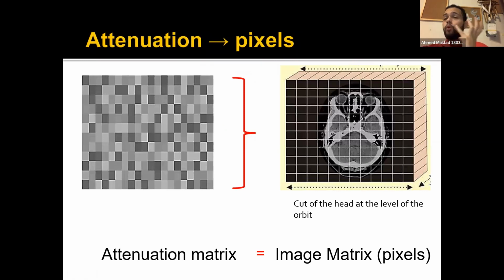And again, that's why it's called computed tomography, all right? Because it's computed. The computer is what gives you the final image, all right? It's not like X-rays, you know? You don't need to pass your X-ray image through a software or a computer to get the image, right? You can get it simply by a film. You don't even need a computer to process this, but in a CT you do.